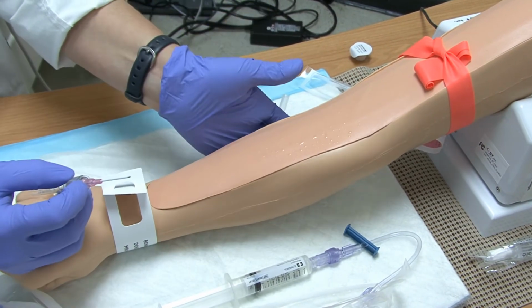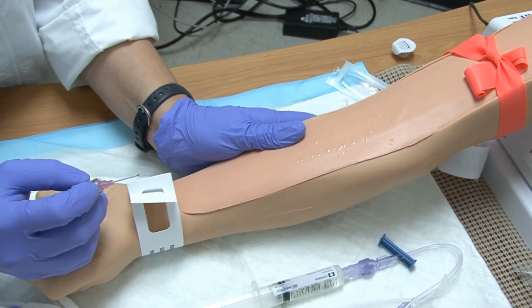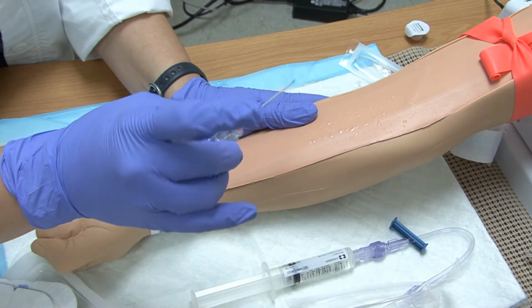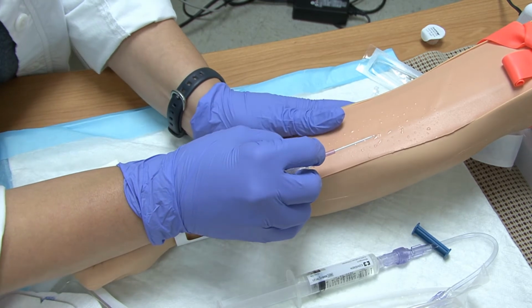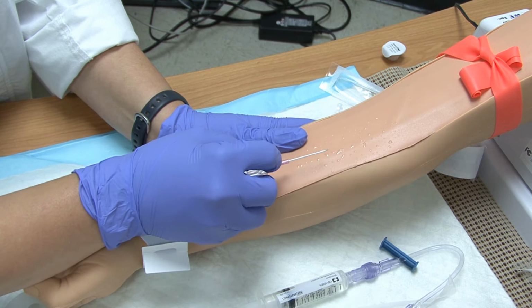When you're holding, you normally want to hold with your non-dominant hand, and you want to apply traction about 1 inch to 2 inches below the insertion site. That keeps the vein from rolling on you, because sometimes the veins will roll. When you go to insert, you're going to insert at a 10 to 15 degree angle. So when you go in, you can enter on the vein or to the side of the vein.